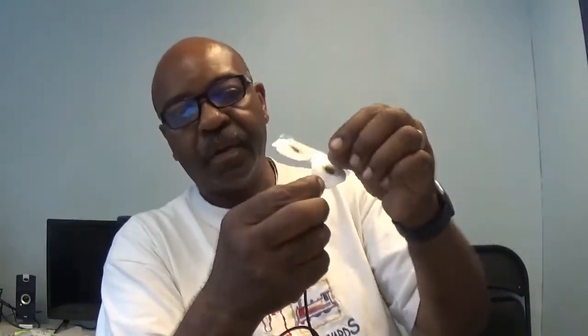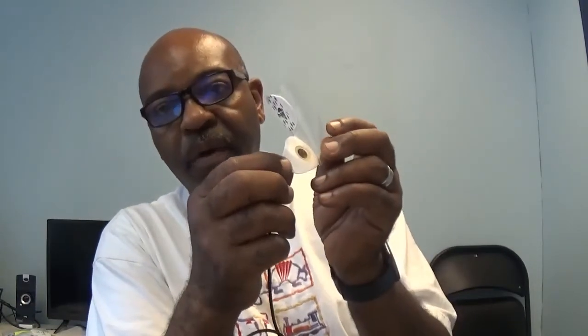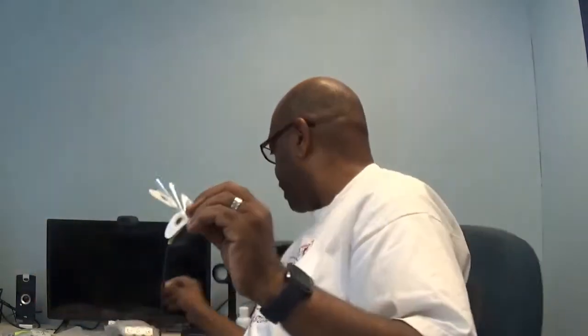instead of putting this on the site that we want to record from, we're going to be putting these 3 on the site. So we would peel one off at a time. Peeling all 3 off makes it kind of clumsy and difficult to manage because they start sticking to each other and everything else. So you peel one off, and with this type you're not adding any of the cream or gel because these are adhesive and they're already pre-gelled, so there is conductive material in the adhesive. So when you peel these off, you stick them on and they will stick to the skin, and they also will be conductive.